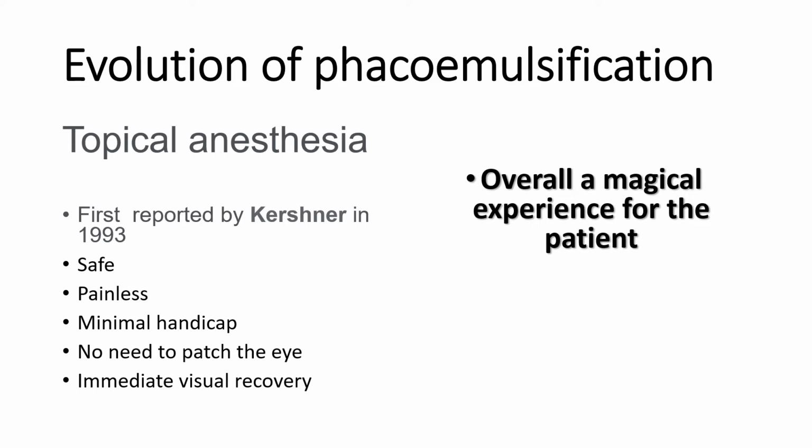This is something like magic, because even a refraction and dispensing of glasses will need at least a day. Here the patient undergoes a transformation in his visual experience within a period of 10 to 15 minutes.